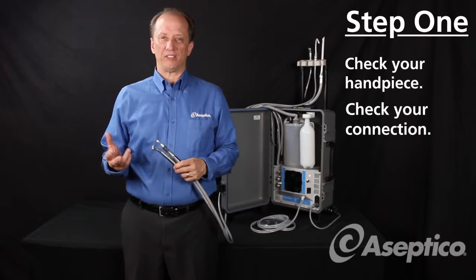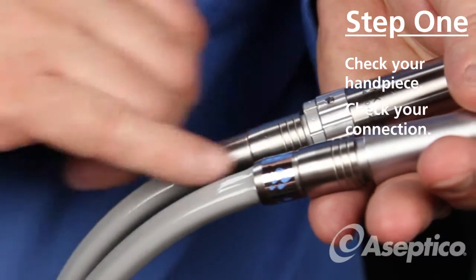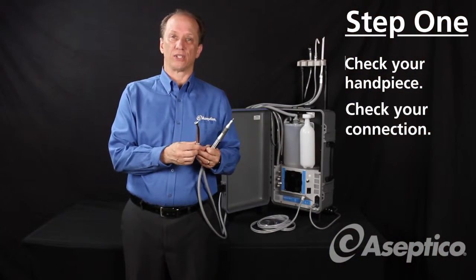If you have the two-handpiece version of the Express, you're going to want to make sure that you only use the line that has the little water droplet sticker on it. That's your high-speed line and actually has the irrigation coming to it, so make sure if you're using high speed that you use that line.